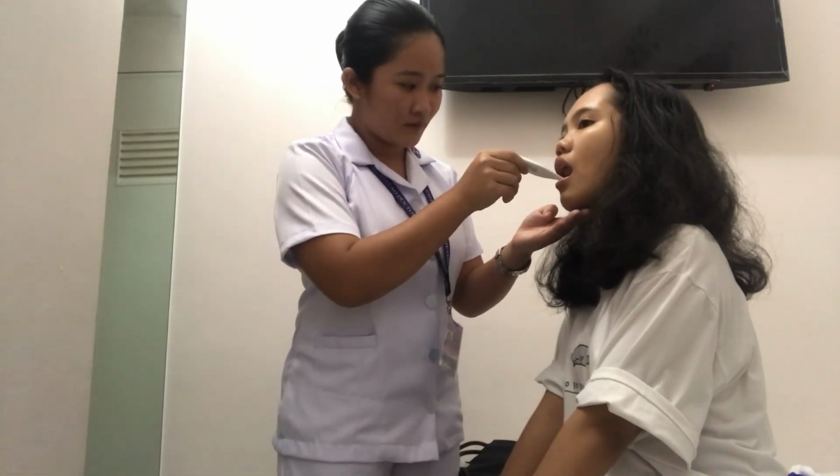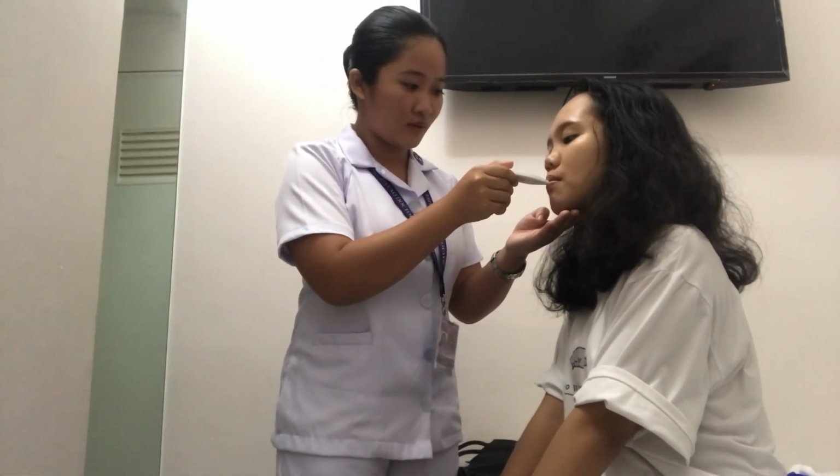Okay, close. Thank you. So now we're going to wait until the thermometer beeps. This is because when the thermometer beeps, it indicates that it has already obtained the patient's temperature.